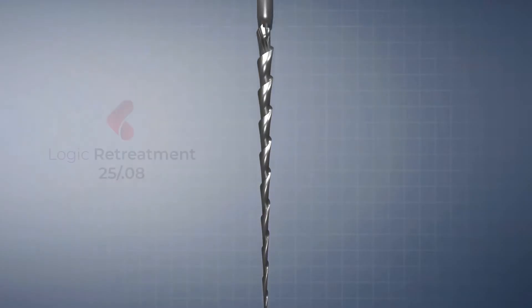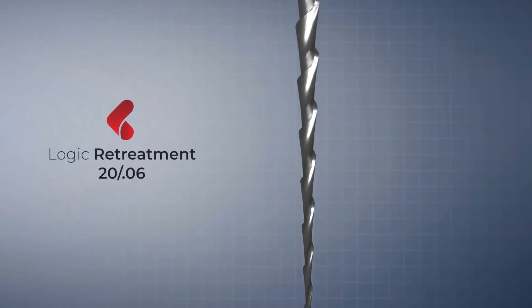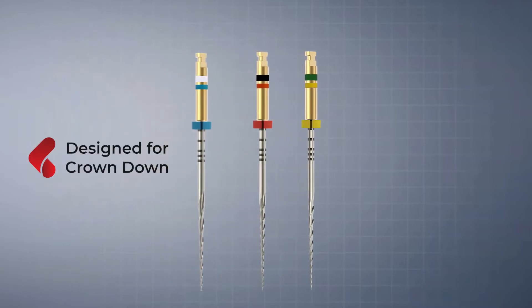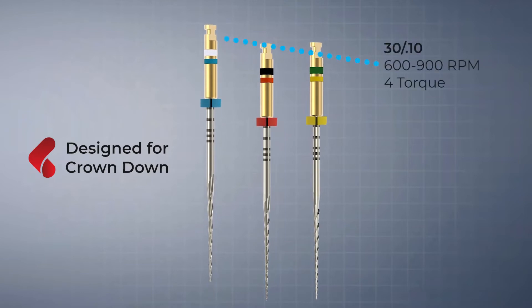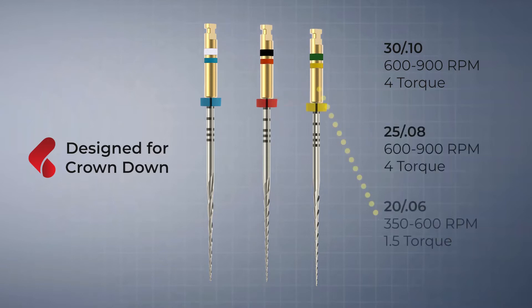There is no need to use other instruments and the procedure with Logic is both faster and cleaner. Bossy Logic re-treatment files should only be used to remove gutta percha and they are designed to follow a crown-down technique, beginning with a 3010, moving to the 2508, and then finishing with a 2006.